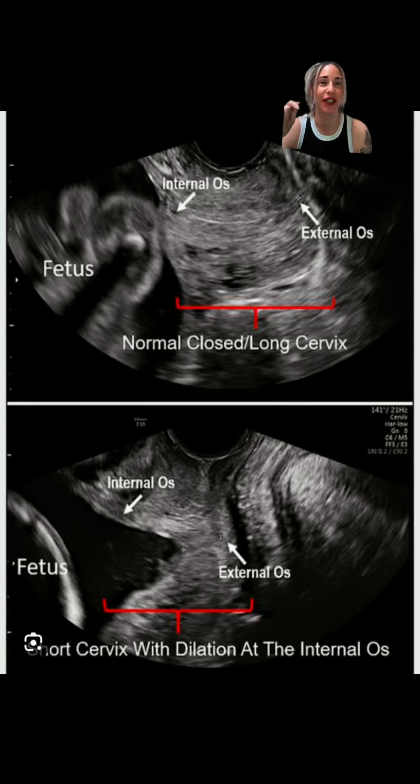Hey sonographers, Jessica here. Let's get into our cervical length, normal funneling, and our bulging membranes.